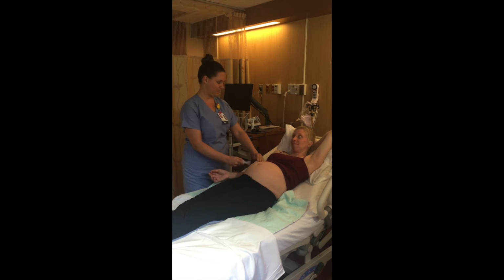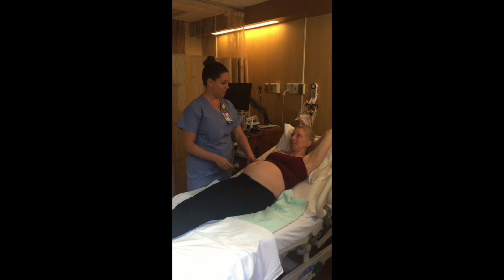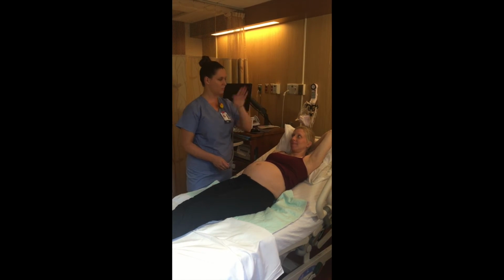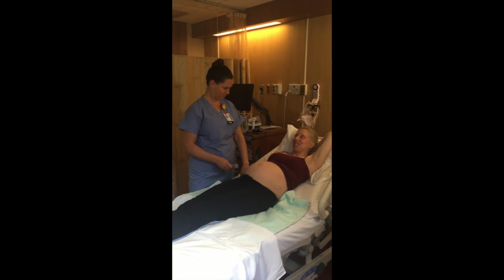Perfect. Christy, your baby's heart rate is about 130 right now. All right. So now we're going to keep monitoring through 2 contractions and 2 resting periods just to determine your baby's response to the labor, and then we'll get you up moving around, okay? Sounds great. Okay. Thank you.